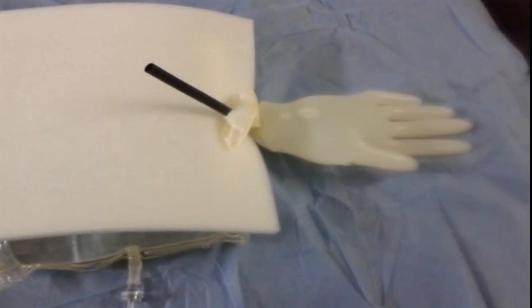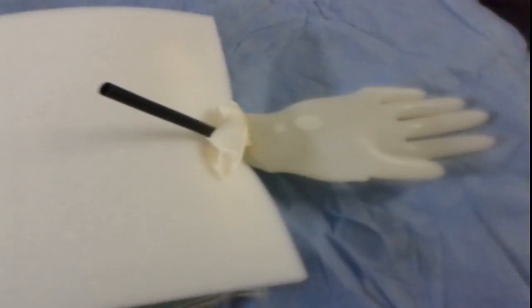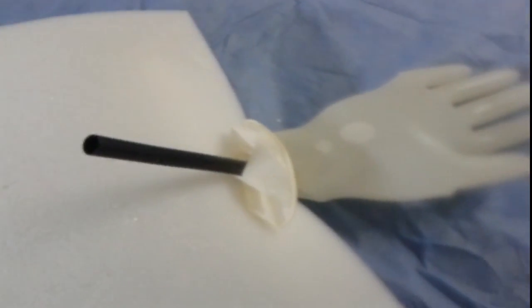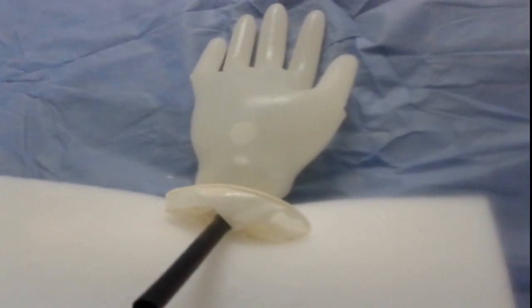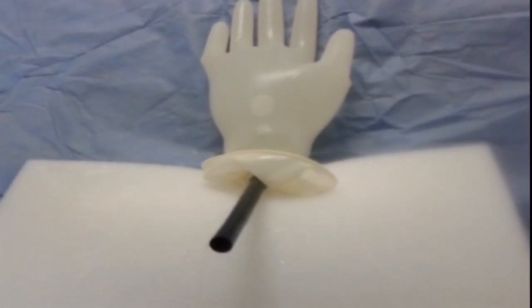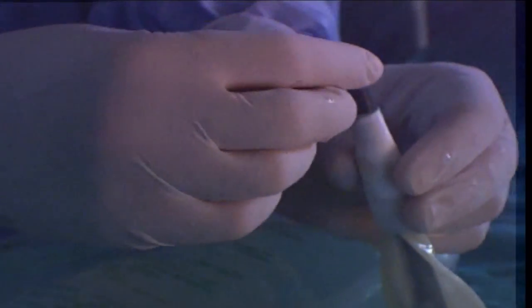An Amplatz sheath is inserted in a glove. The glove opening is closed using ligation. To avoid the use of irrigation, the glove is filled with saline and the Amplatz sheath is elevated. Small stones are introduced into the glove.